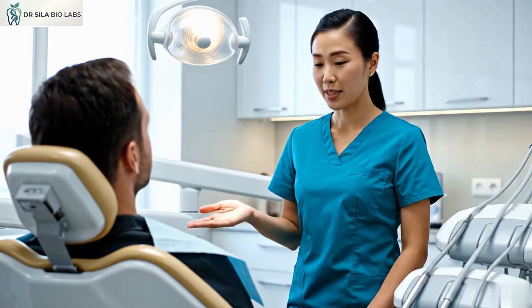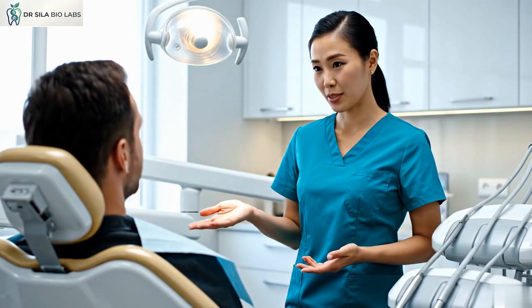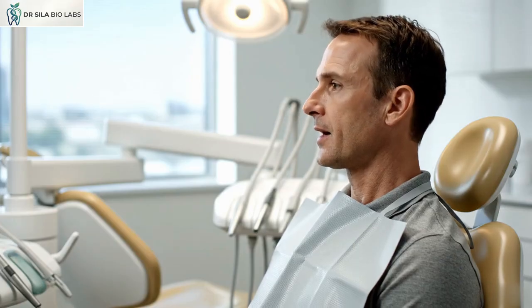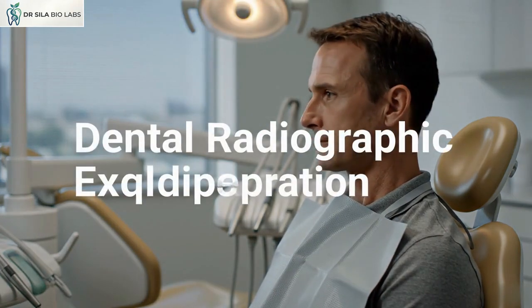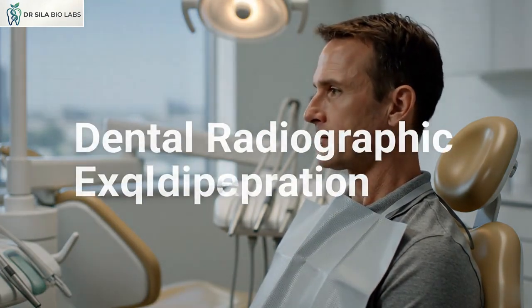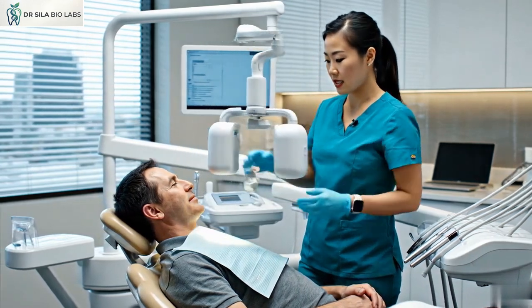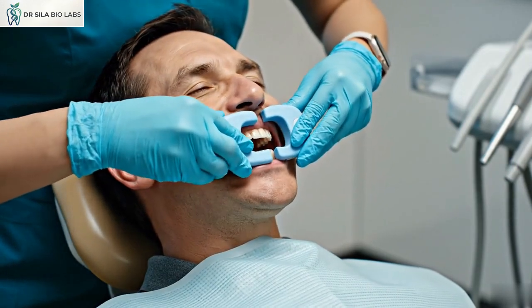While a clinical examination provides valuable information, dental x-rays are essential for confirming the diagnosis and planning treatment. X-rays allow the dentist to see structures hidden beneath the gums and inside the jawbone. We're just placing the sensor now. Nice and easy. Go ahead and close your teeth together gently and try to stay perfectly still.